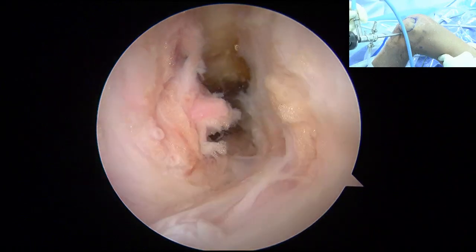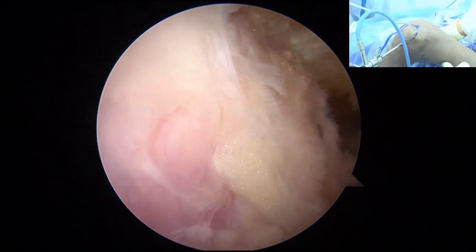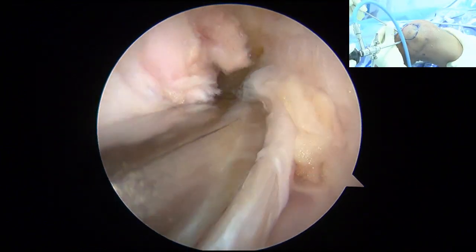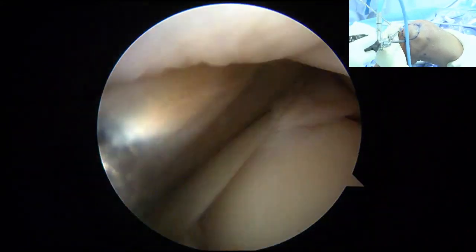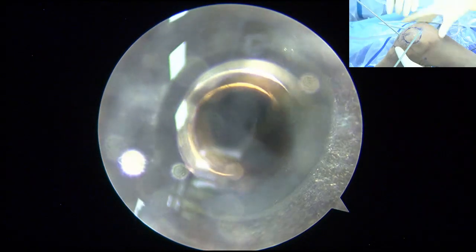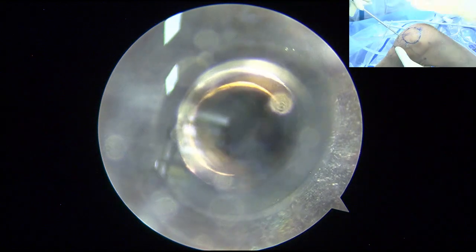Good. Okay. And you can see better if you switch your camera from here. I always use my switching stick, okay, to get in the joint, okay? Switching stick. Every time you change the portal, use the switching stick. 我器械换通道的时候都会用交换棒。Okay. Okay, good.